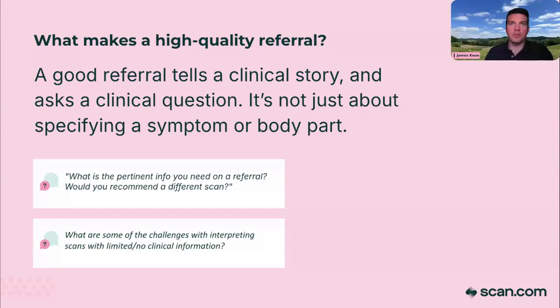I think I'd throw in personal and clinical history in there as well. Certainly as a radiographer, but I think the radiologist as well, we don't typically have access to the notes, or won't have seen the notes. We don't have any kind of history. If the imaging was done elsewhere, we won't necessarily have that either to refer to. So very often we're working almost completely from just the referral form. So if you've sent the patient for a chest CT and they've had a lobectomy in the past, we don't know that unless you tell us.